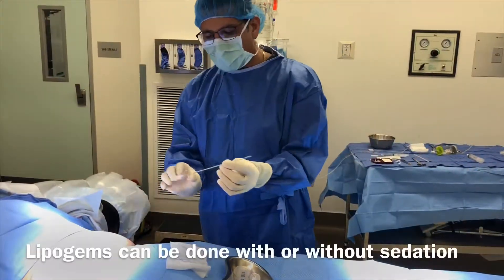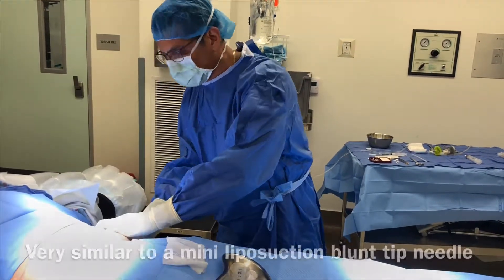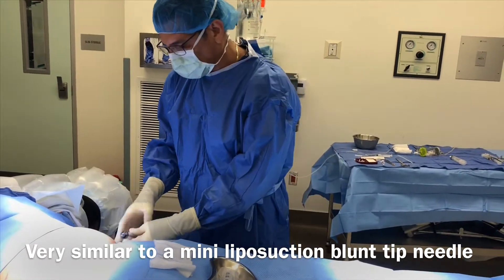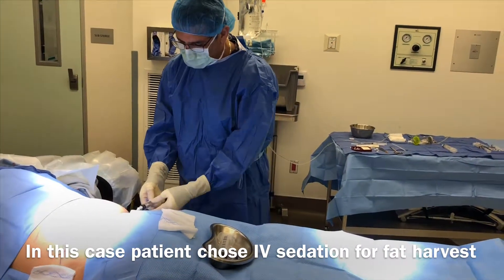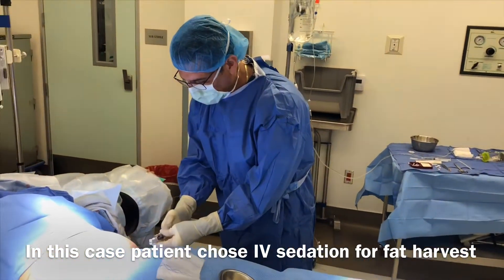So this is a fat harvest needle. The patient's already numbed up. It's basically like a liposuction procedure almost, but we don't call it liposuction — it's a fat harvest. It's a special syringe that locks and applies a vacuum type of seal.